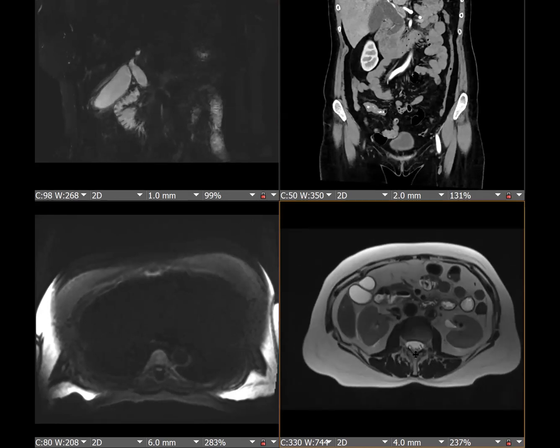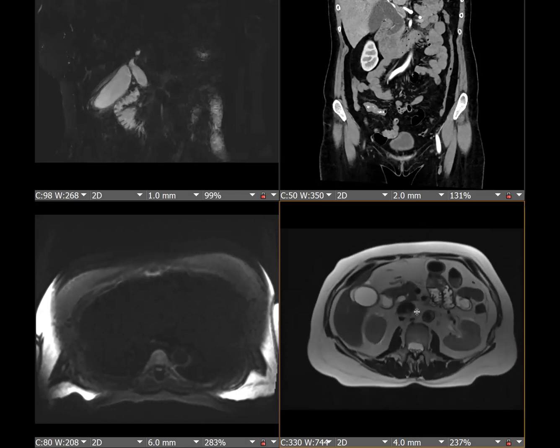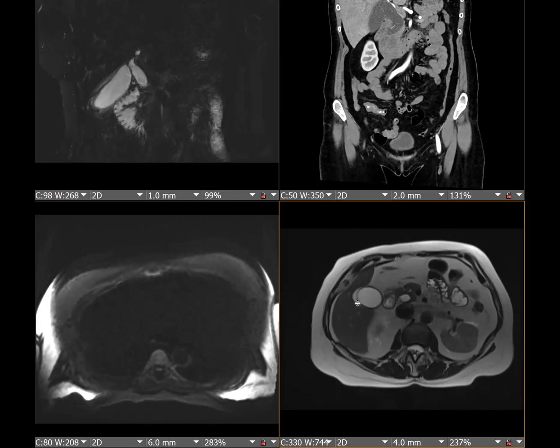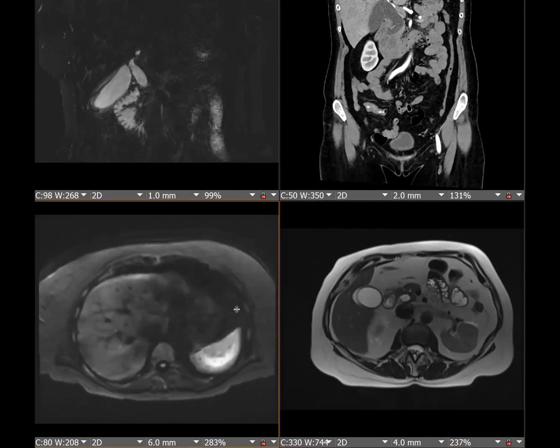Interestingly, that diverticulum had decompressed. So whatever stuff got stuck there that gave this patient pancreatitis and dilated bile ducts did eventually move out of there. There's a little bit of air and fluid in here on our exam. But the other interesting thing about this were these foci of restricted diffusion.